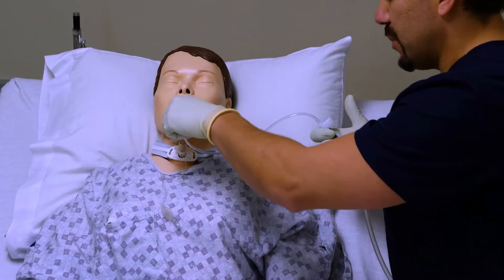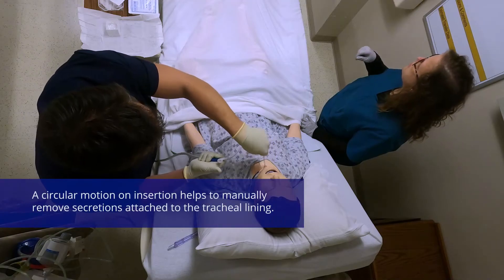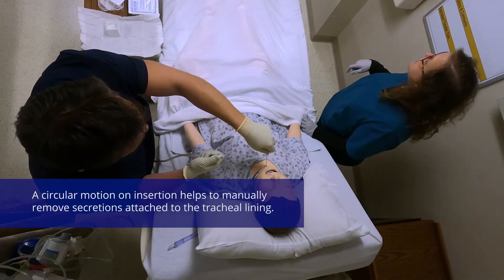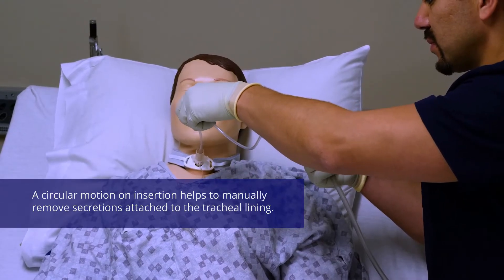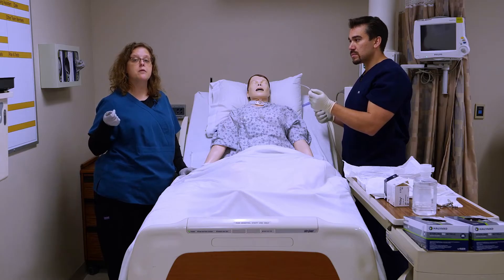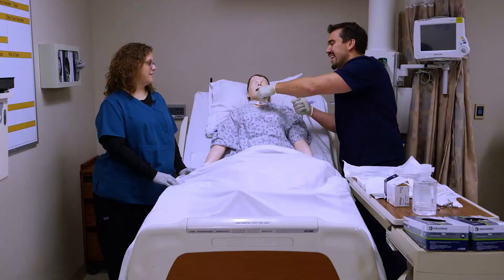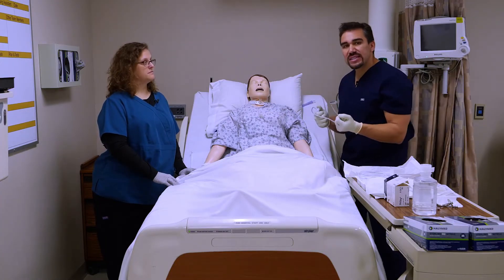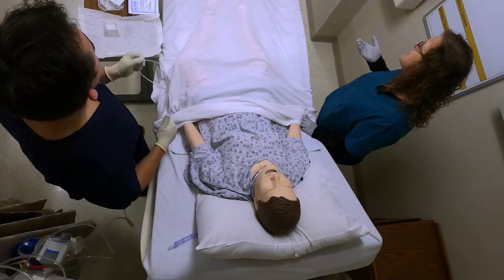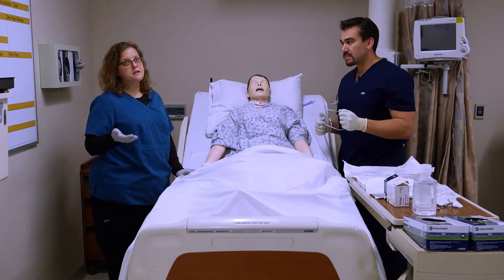When going in, he's using a little bit of a circular motion to make sure that he gets all of the walls of the trachea and really loosens up that suction. You're going to notice he's pulling out some secretions, but you should also really expect the patient to cough and cough up more secretions because he's loosened them up. It's totally normal to have to make a second or third pass to get those out. This patient doesn't have the normal protections that would keep mucus free from the lungs and trachea, so this is all totally normal.